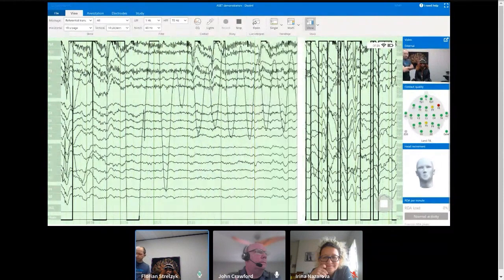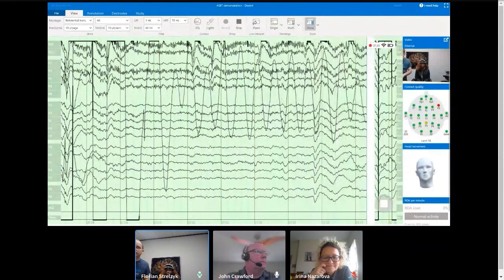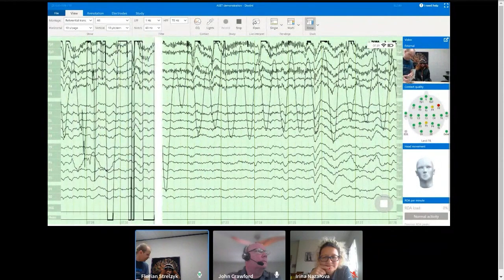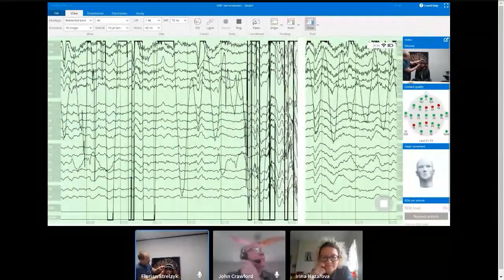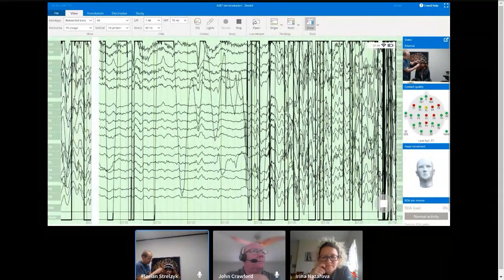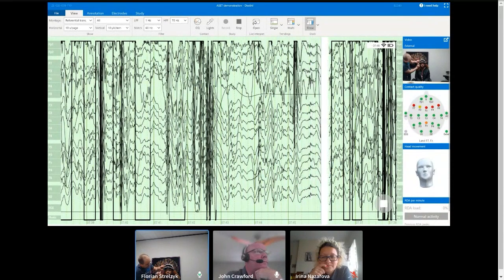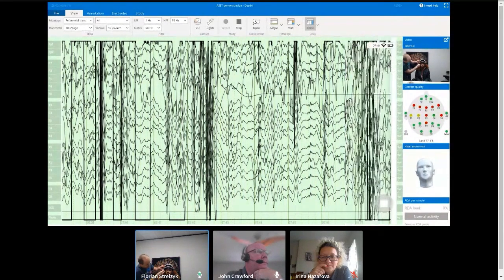Yeah, guys, you know what I'm going to do? That's also a nice thing to show. I can swap out an electrode while it's on the head. That gives me the ability to push the hair back a little bit and then apply a fresh one.